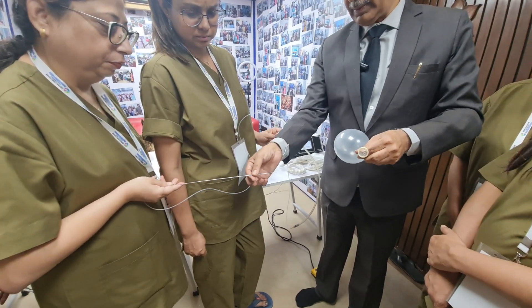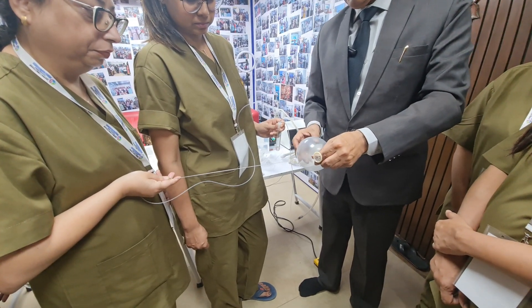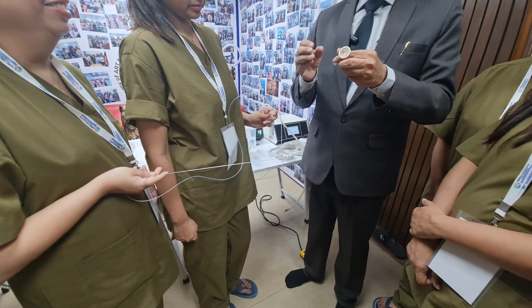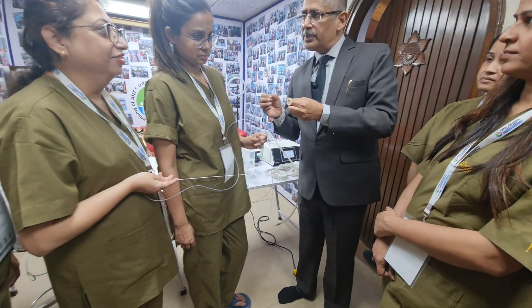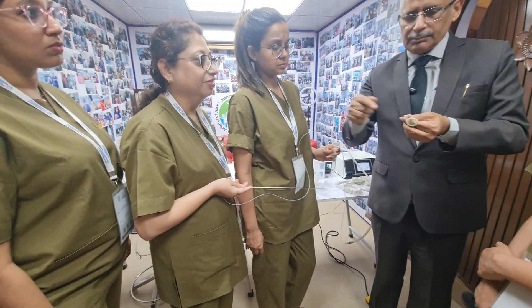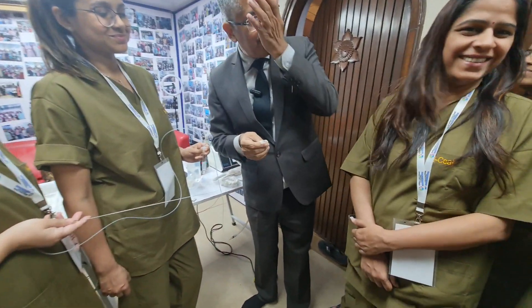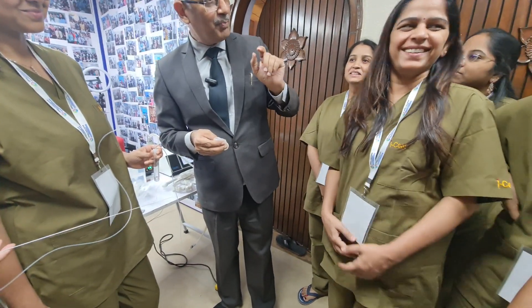She's going to go inside — keep your hand stable, madam, keep your hand stable. She's going inside. That's how your follicle ruptures, but before it ruptures it will tend to deform. Look at what has happened to it. Indra, where are you? Indra is sitting over the diaphragm, near the diaphragm.